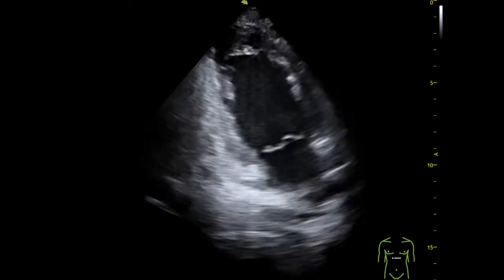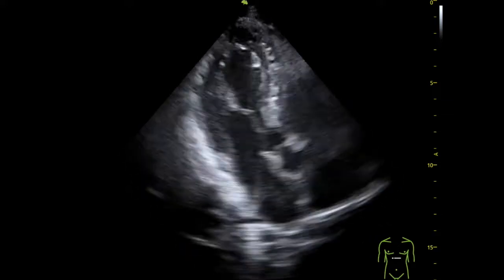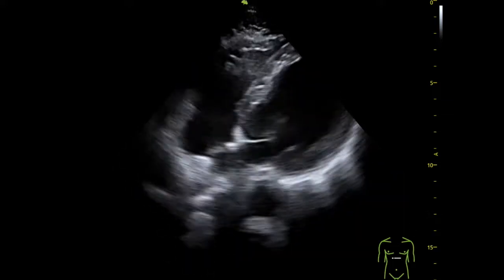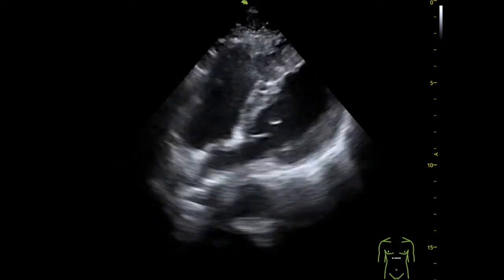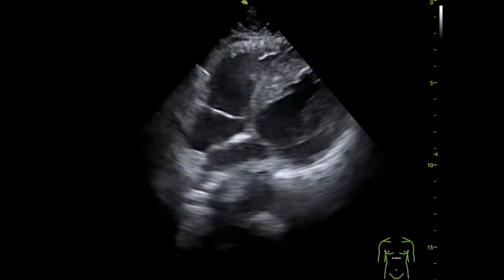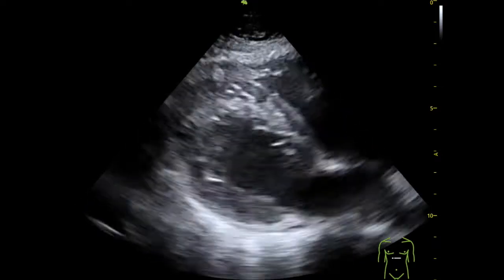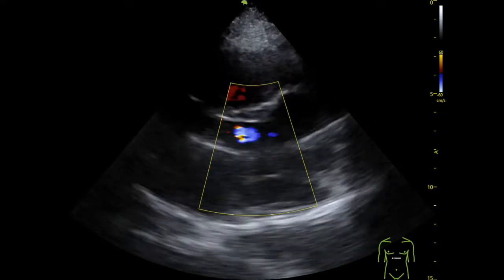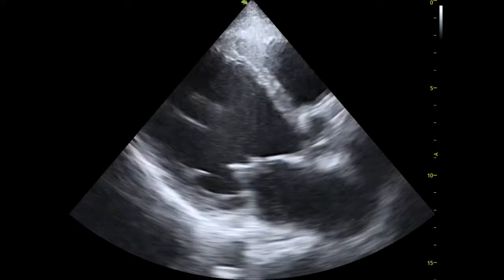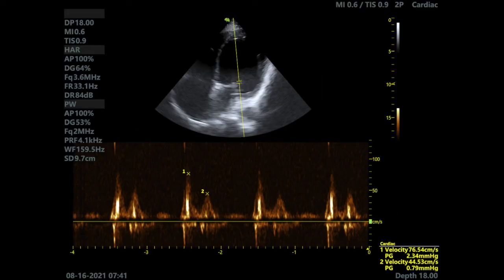Here we're seeing an apical 2-chamber and now the apical 3-chamber. Here is a subcostal view and you can see that the definition is still quite high. This is a normal parasternal long axis with sharp endocardium borders, and here you can see the color Doppler spark in the aorta. This is a patient with heart failure in a parasternal long axis view, and this is the pulse wave Doppler with peak velocities shown on the bottom right.